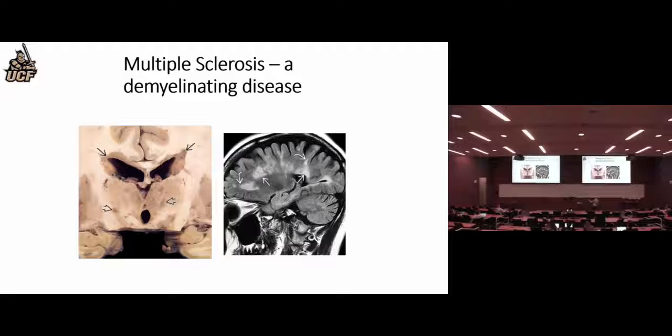And you can actually see some of it. I think I see some, this is the cerebellum down here. I see some in the cerebellum as well. But definitely all this white fluffy stuff, or it looks a little like cotton. It looks like cotton, and if you take a ball of cotton and you sort of pull it out, it looks sort of like that.